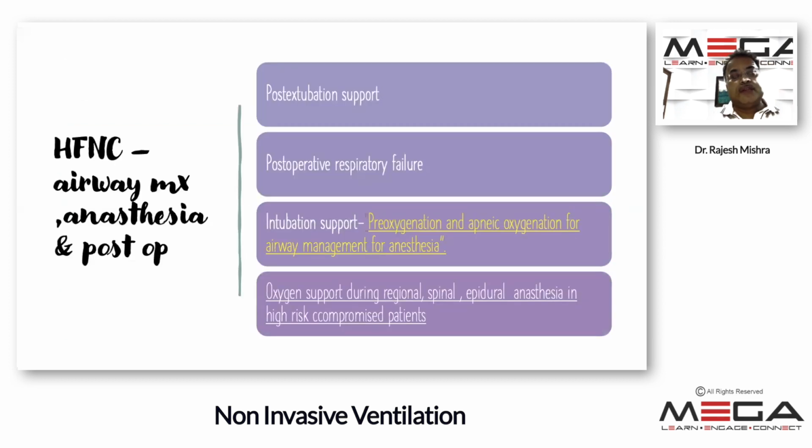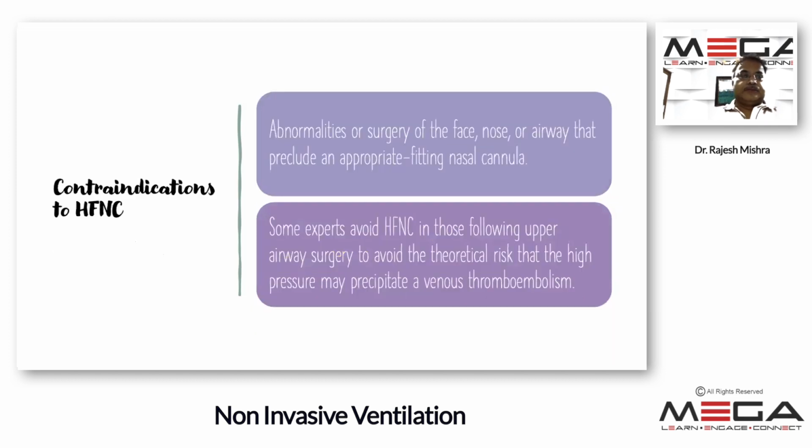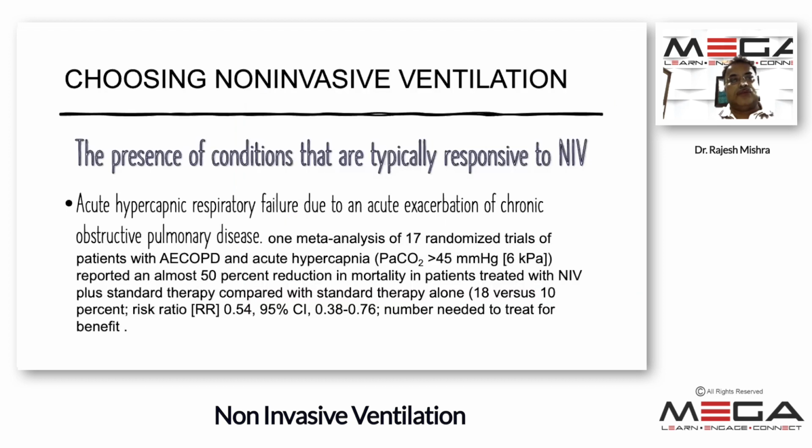HFNC in airway management, particularly post-extubation support. There may be some airway edema which needs around 12 to 24 hours to settle down. For that period of time, HFNC can be used. Post-operative respiratory failure, mild to moderate respiratory failure: if you leave this patient, after some time the patient becomes hypoxic and needs to be intubated. To avoid that intubation and to take care of that atelectasis, you can use HFNC in these patients. Contraindication of HFNC is if there is a severe injury to face and nose.